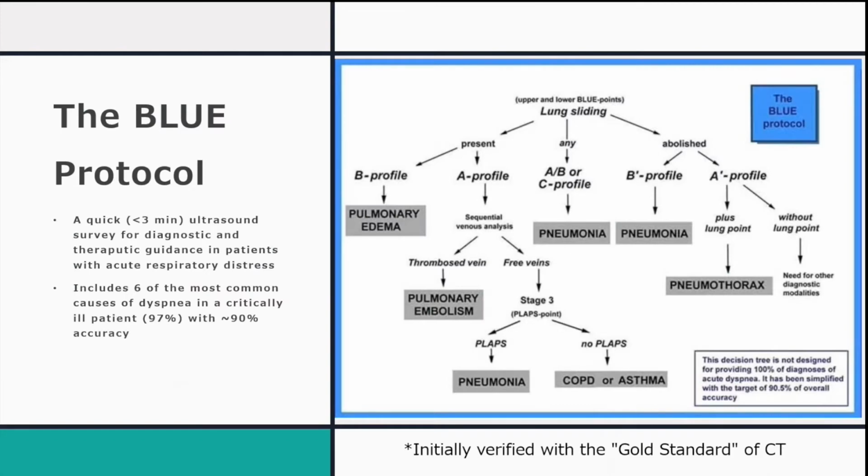So what does BLUE stand for? BLUE is an acronym. It stands for Bedside, Lung Ultrasound, and Emergencies. And essentially the BLUE Protocol is an algorithmic way of ultrasounding critically ill patients who have acute respiratory distress for diagnostic and therapeutic purposes.